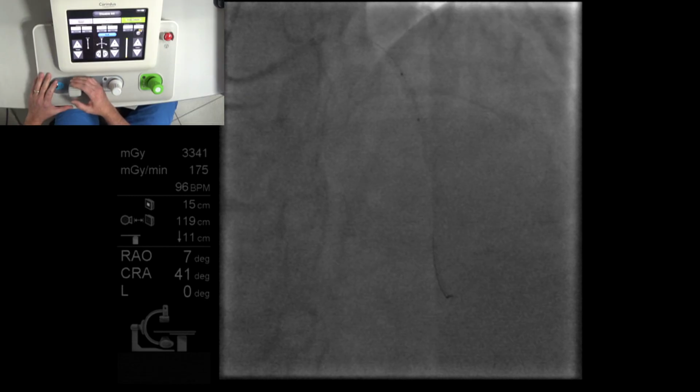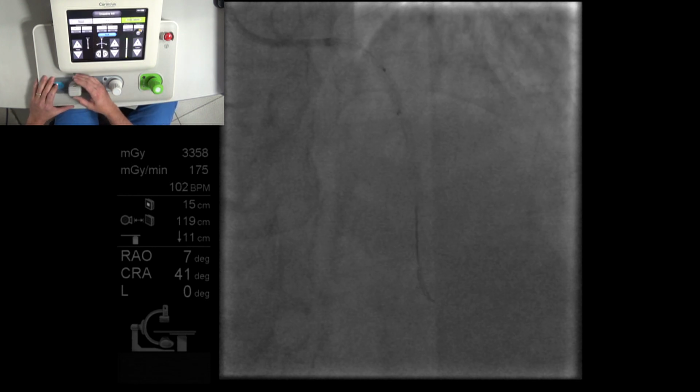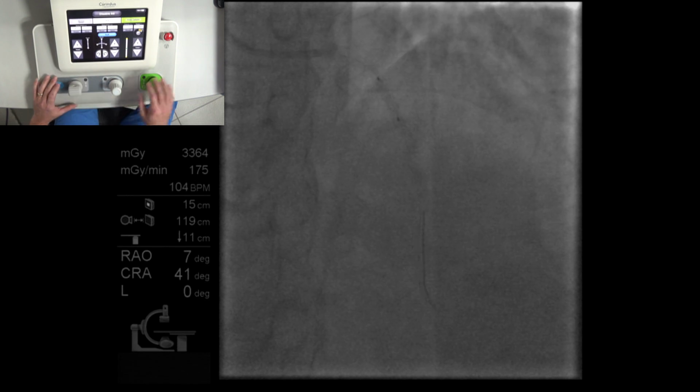Now my wire's going to move forward. My guide's going to suck in, but hopefully, okay now. I think we can leave it at that point. I'm watching that guide. And as the balloon releases, the guide's got to go back forward, and that takes two hands to do that move. Okay, ready? Final picture.